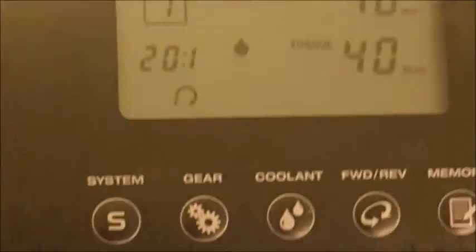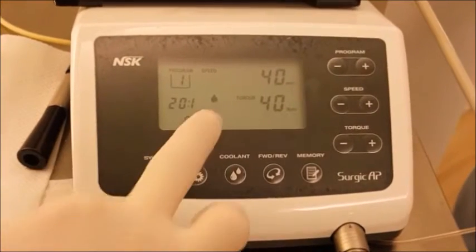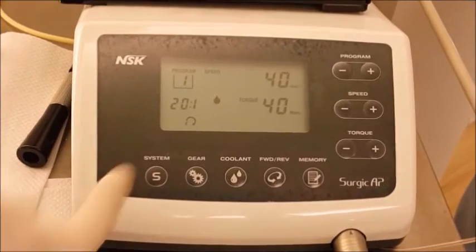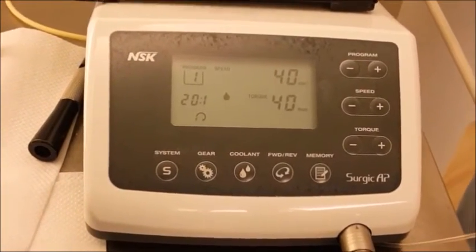Now we need to change the settings on the machine. Set the speed to 40 revolutions per minute and the torque at 40. We've cut down the irrigation as you don't need that now.